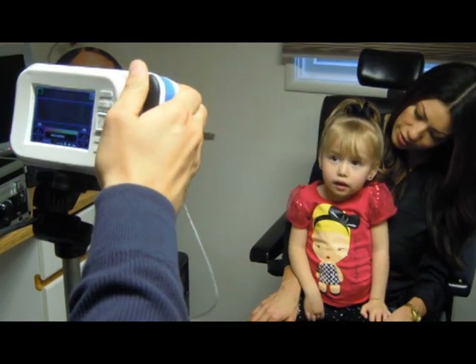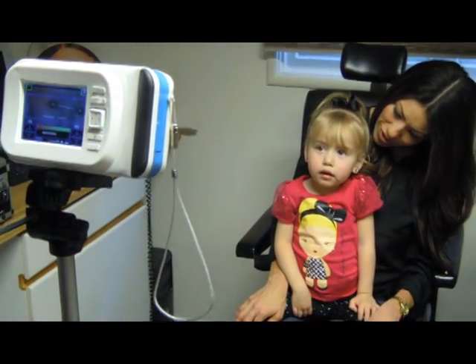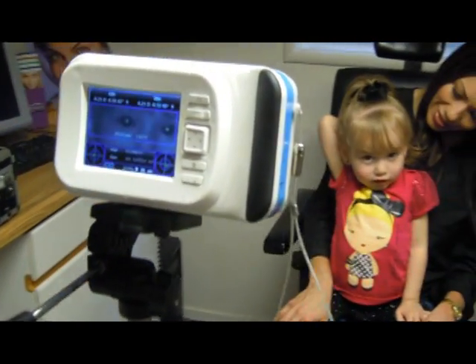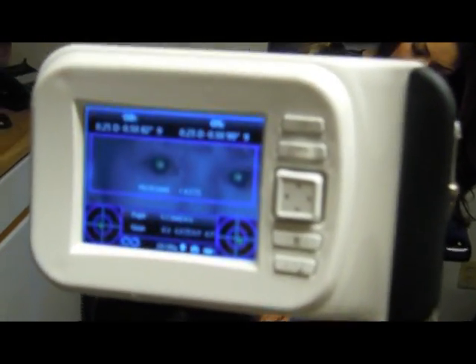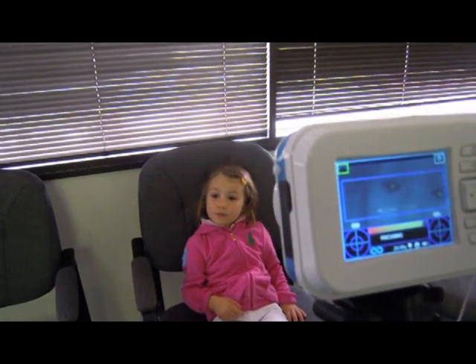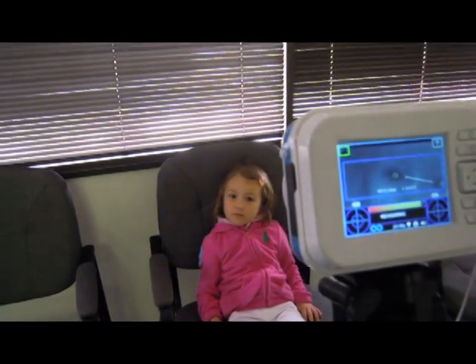Working in natural binocular conditions, the 2-WIN simultaneously enables you to evaluate not only refractive errors, but also gaze direction, ocular alignment, pupil diameter, pupil distance, and the accommodative balance or imbalance between the 2 eyes. This all-in-one process is easy and effective for you and your patient.